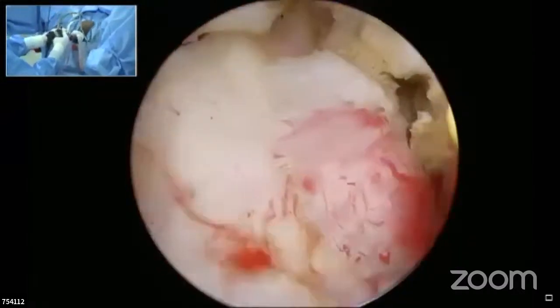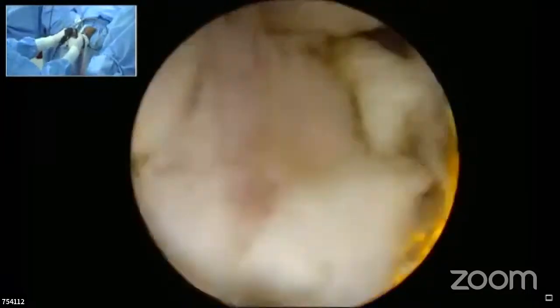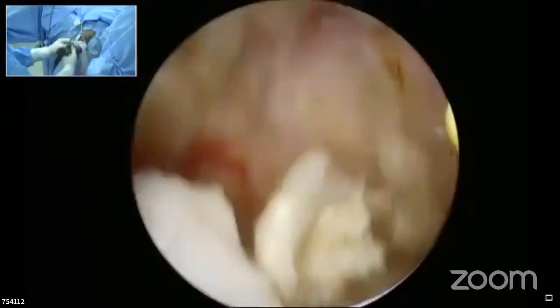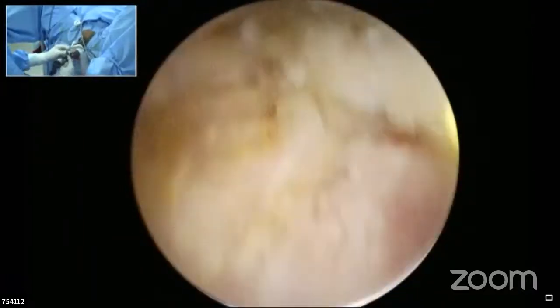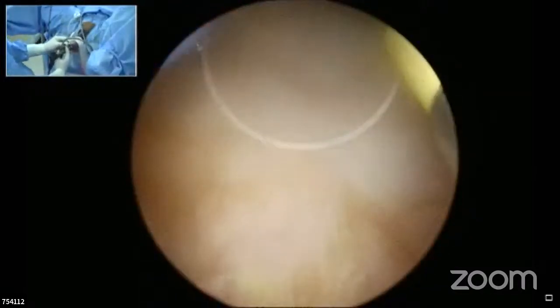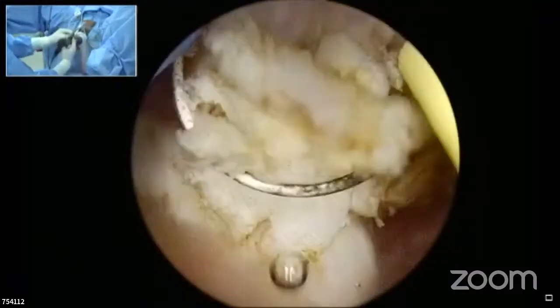So having this tissue at the apex will come in the way of achieving a complete debulking of the adenoma because the hinging effect will happen. So as much as feasible, we would be debulking and coming back later once the opposite side is debulked. So I would debulk it for some more extent and then proceed for the left lobe.